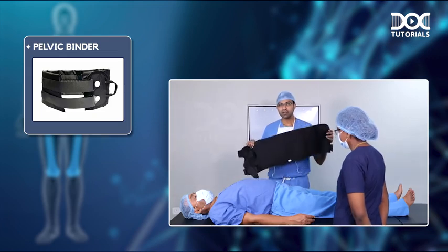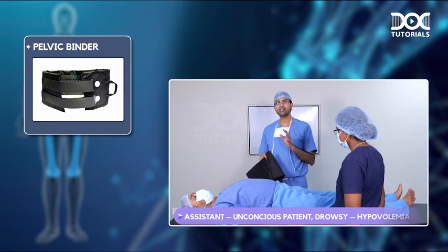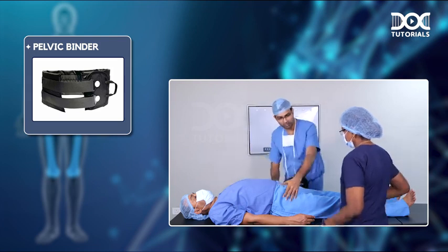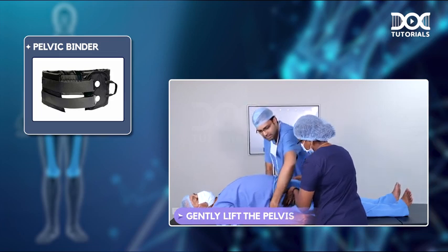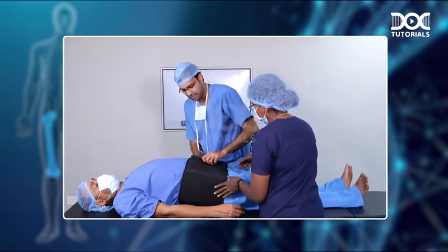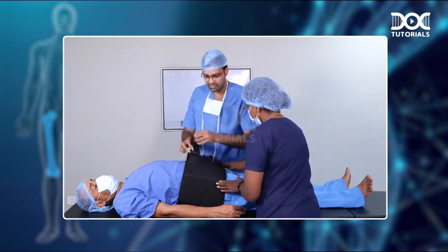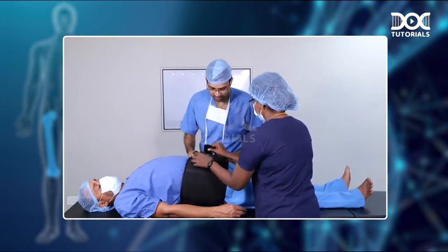So how do you apply this pelvic binder? It is quite easy, but you need an assistant for this. Usually the patient would be unconscious or will be drowsy because of hypovolemia. And what you will do is that you ask the assistant to hold the pelvis like this and gently lift up the pelvis. And when the assistant is lifting the pelvis up, we put the pelvic binder around the pelvis. And once you do that, you tighten the straps in the pelvic binder. You have to tighten it as hard as possible.